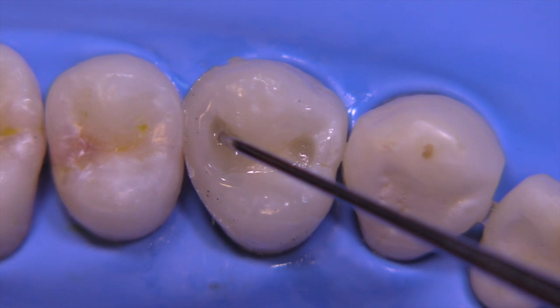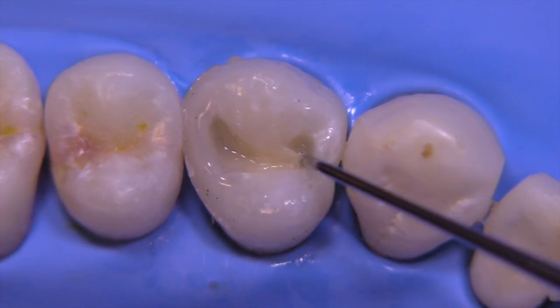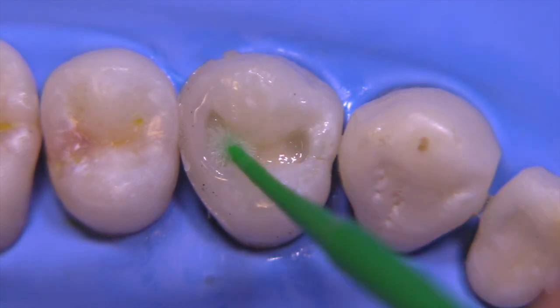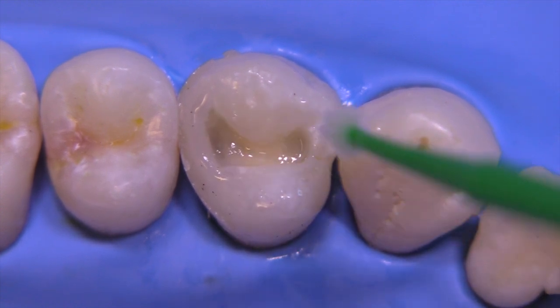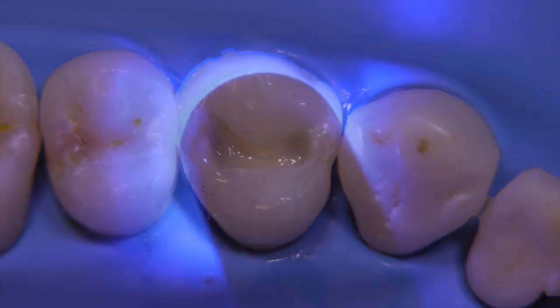Then I'm going to fill that defect with a flowable composite and spread that around a little bit so that it fills the corners of this preparation, which was a little too sharp for a typical composite — it was really prepared for an amalgam. We're going to remove any excess flowable because we need that space for our contour buildup section coming next. Let's go ahead and light cure this.